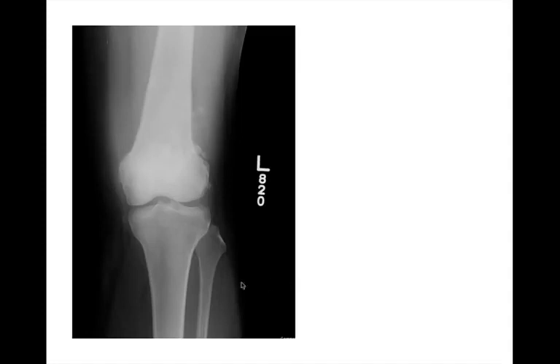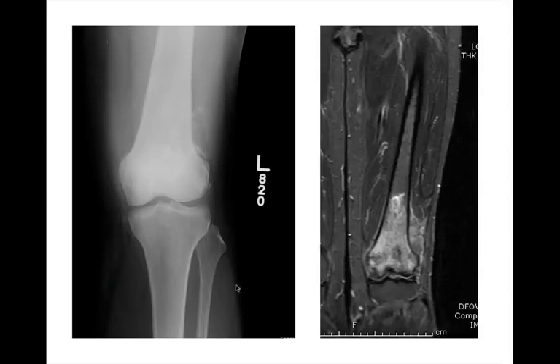Another knee frontal radiograph. This is a sclerotic, geographic lesion with a wide zone of transition. It's fairly centrally located in the metaphysis of the distal femur. Note there's some periosteal reaction. On MR we can see the extent of the lesion and there's a soft tissue component as well. This was an osteosarcoma.